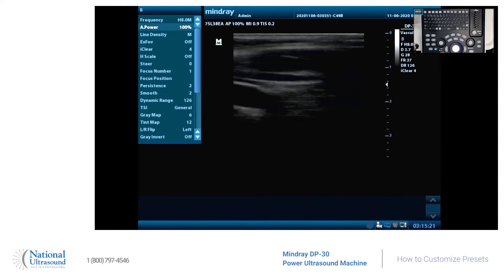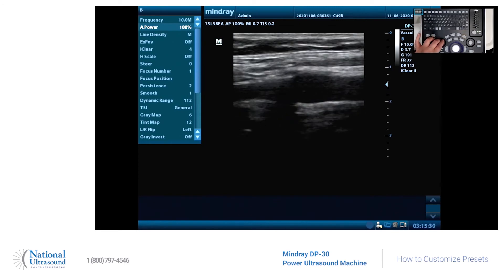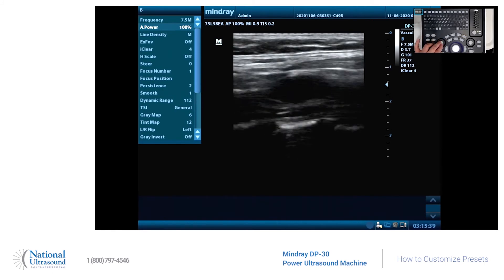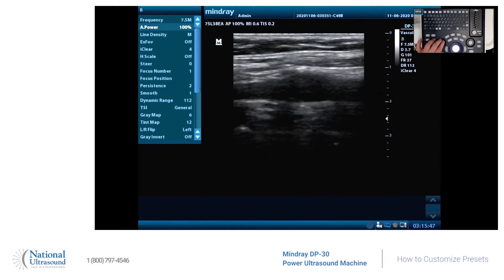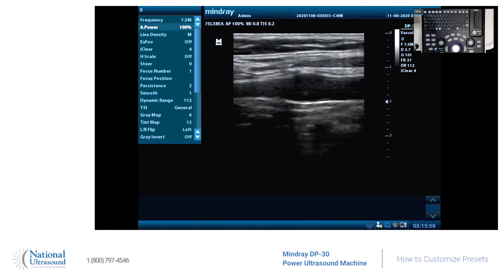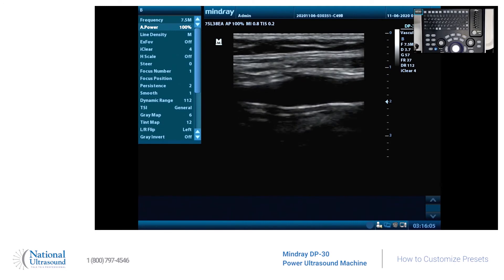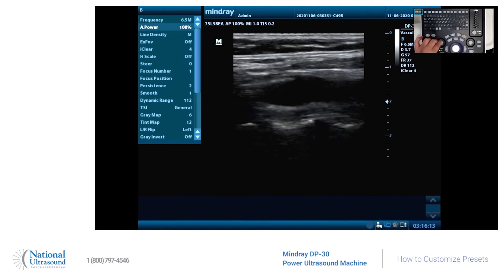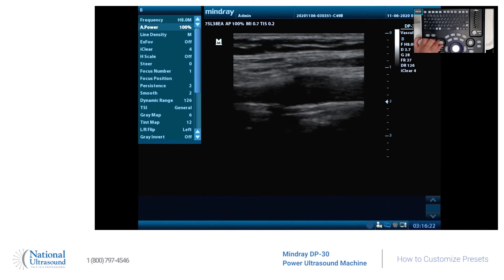Okay, that's good. Let's see what else we like. Here's 10 MHz, 7.5 — there's that. I'm just moving the focus zone, and let's increase the depth so you can see it really close. So for frequency — this is 6.5 fundamental, there's 5 which is a little bit more grainy, 7.5, 10, and harmonics.